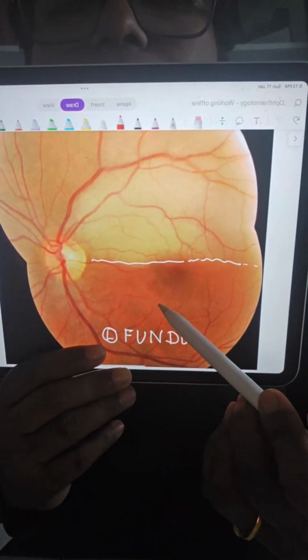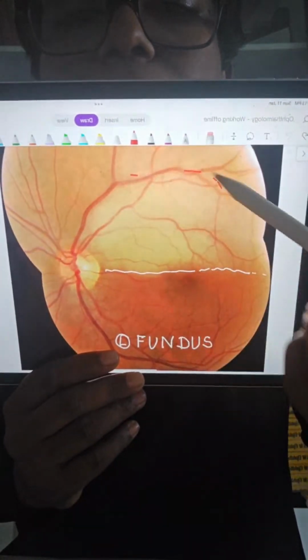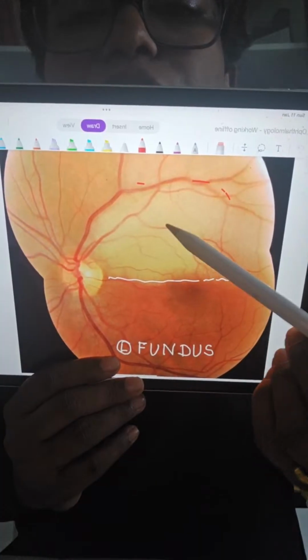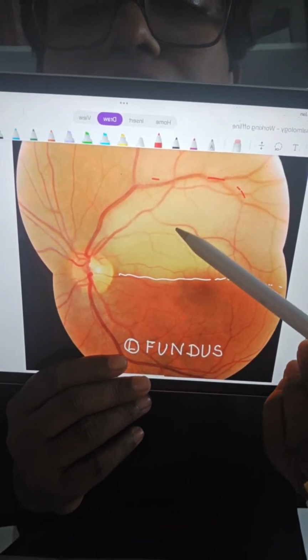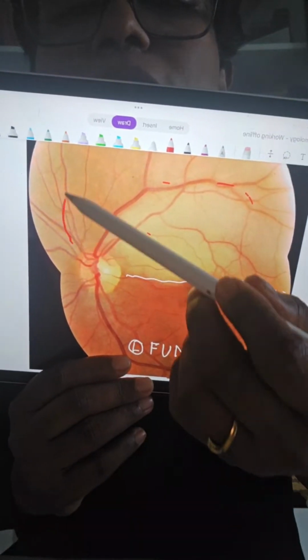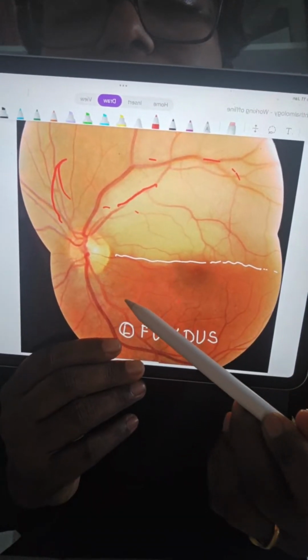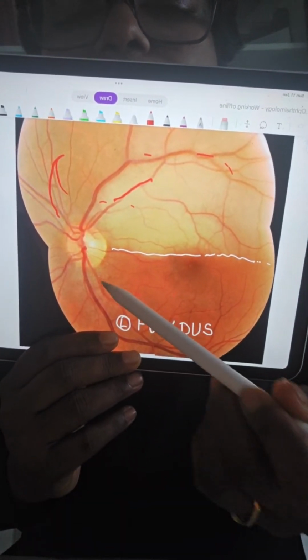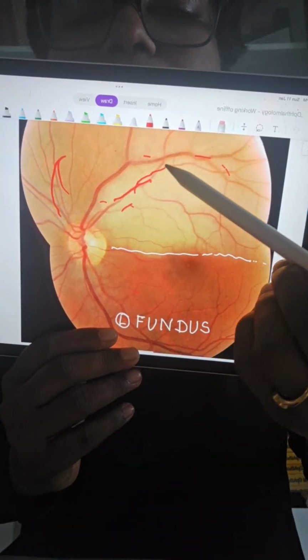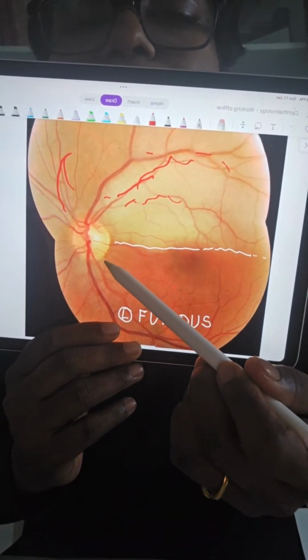The normal color below, and almost the entire upper half, there is this occlusion and therefore there is a retinal edema. Yes, can you see that? And can you see all these arterioles? All these arterioles are attenuated, whereas below you can see the arteriole is a little bit attenuated but not entirely collapsed like these. These are just streaks, completely collapsed.